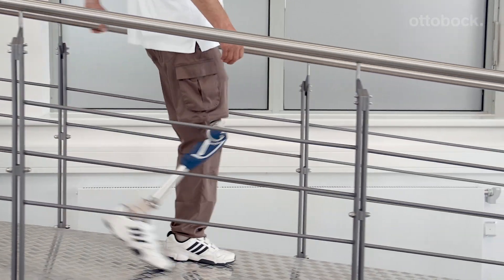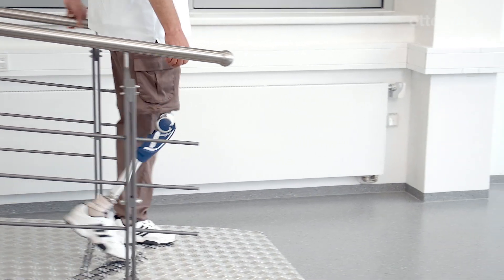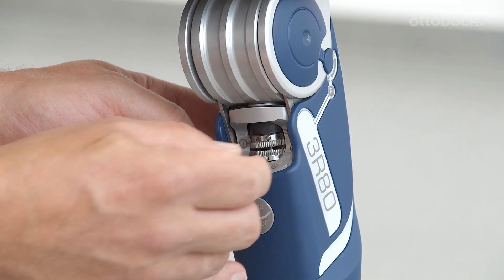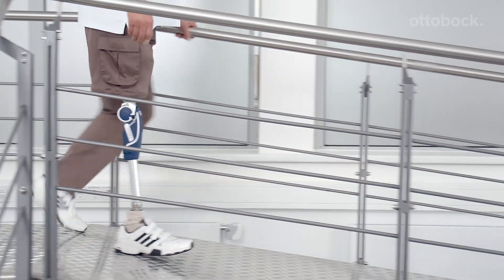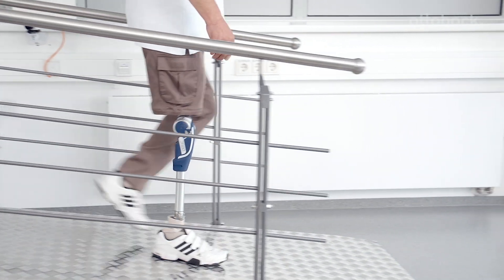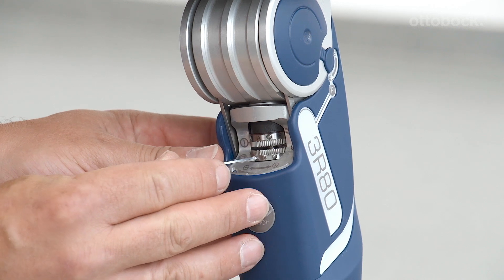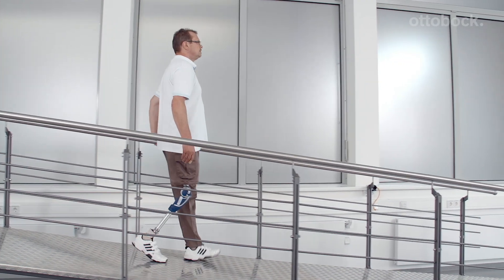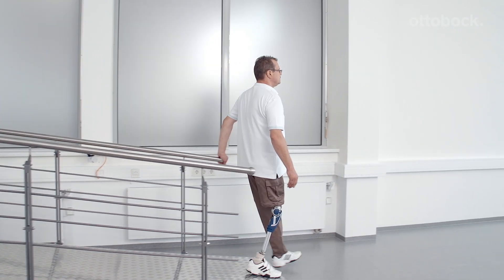Here, the stance phase damping is set too high. When walking down the ramp, the stance phase damping needs to be gradually decreased. If the resistance is too low, the user could become unstable. At this point, the damping is set too low — the prosthesis bends too quickly and prevents the user from taking balanced steps. The damping must be increased in small increments. When the stance phase damping and its threshold have been set correctly for sitting down, the settings for walking down a ramp must also be checked and adjusted if necessary.